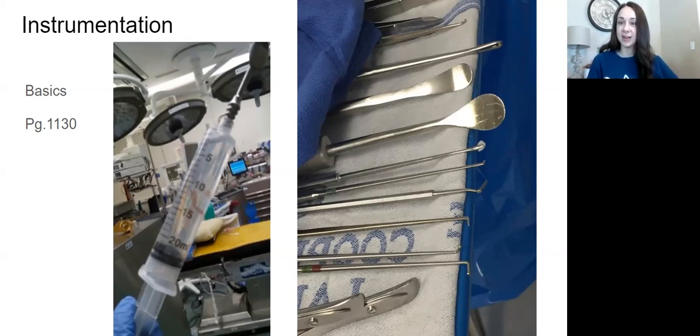Now, if you get one out of an instrument tray, that is more old school and that will be re-sterilized and reused. So after that, it gives you some more options for drilling, and I got a whole slide on drills, so I'll stop at Gigli saw.